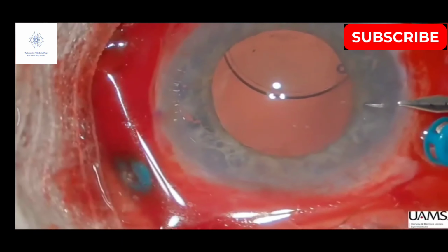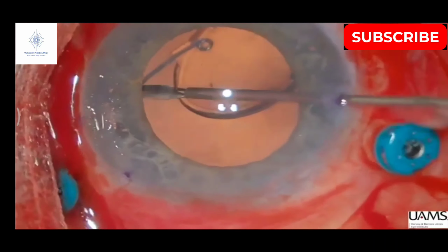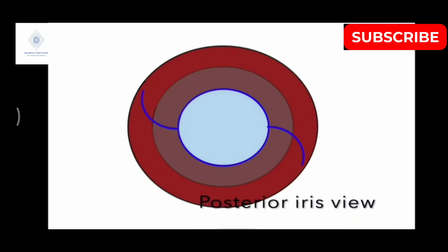We now make a couple of 1 mm anterior chamber paracentesis incisions for manipulating the lens in the AC. The free-hanging displaced haptic is grabbed and brought into the anterior chamber. Let's now take a minute to discuss the anatomy of the lens position and the strategy for removing it.